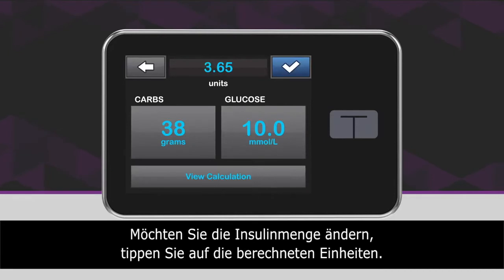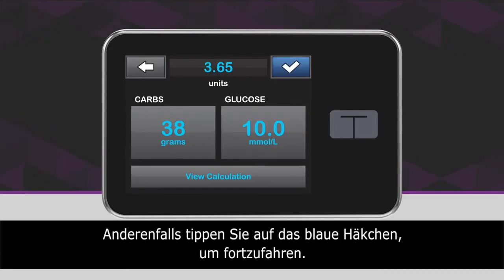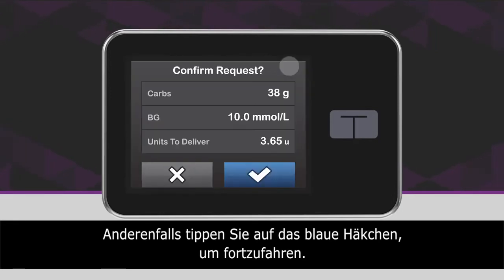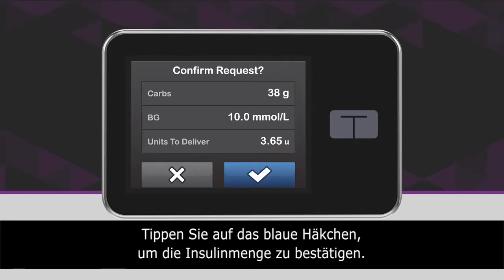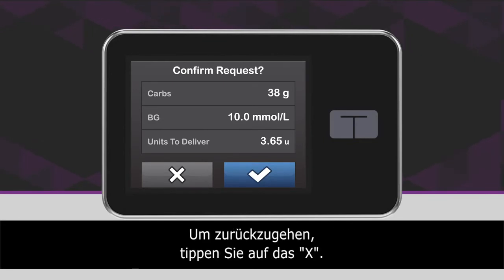If you wish to change the bolus amount, tap the calculated units value. Otherwise, tap the blue checkmark icon to continue. Verify the dose and tap the blue checkmark icon to confirm. To go back, tap the X icon.